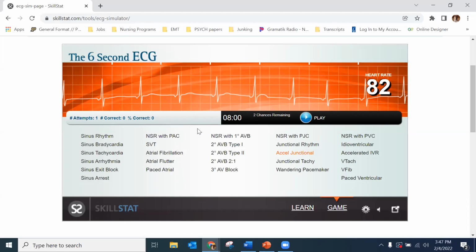So I don't know for sure, but my logic is the T wave is a representation of your ventricles repolarizing. Technically your ventricles fired. Your signal started at the AV node. It went through and made your ventricles fire, which is why you have a QRS. So I'm assuming you should have a T wave because your ventricles need to repolarize, which is what your T wave is after having fired.